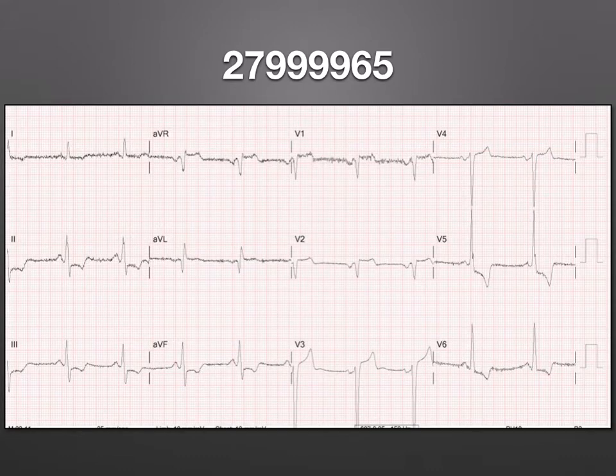So here's his ECG, and we see some elevations, particularly in V3, V4. This isn't the world's most shattering elevations in the world, by any means. But what we do have here is a really strong story. So this is a good example of weak EKG, not non-existent EKG, and strong story.